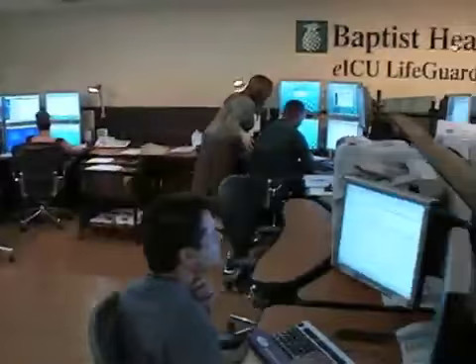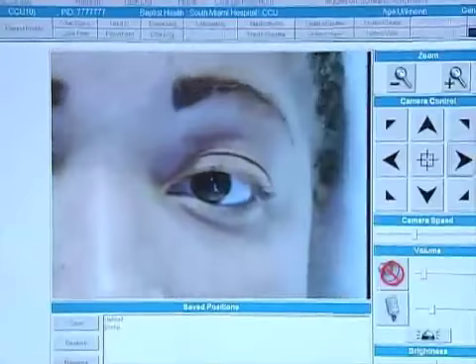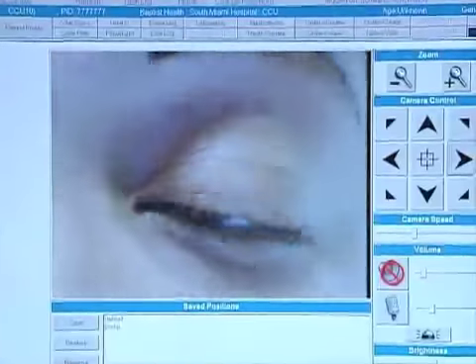The off-site specialists make virtual rounds on set schedules, supplementing visits by the patient's doctor. Depending on the severity of the patient's condition, they make 90-second detail assessments every 1, 2, or 4 hours. Off-site specialists have access to the same vital signs, blood test results, and x-rays as doctors and nurses at the hospital. One of the really great things about the workstation is the camera. You can zoom right into the room, you can look at the IV pumps, you can look at the ventilators, and I can even get close enough to look at the patient's pupil. It's a really great tool.